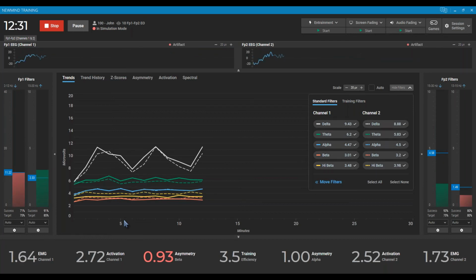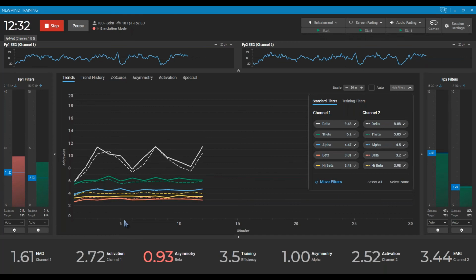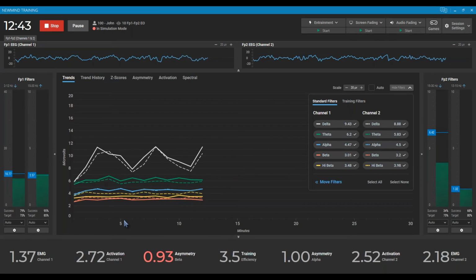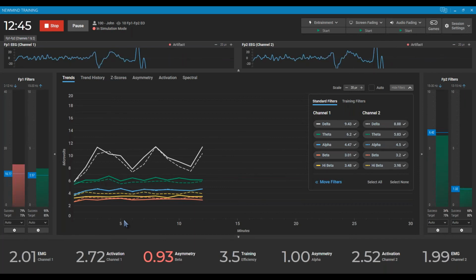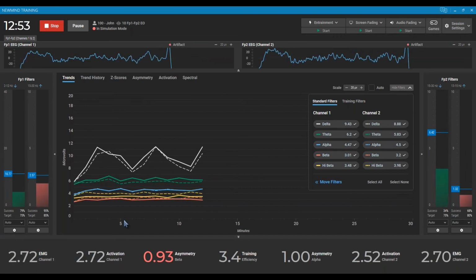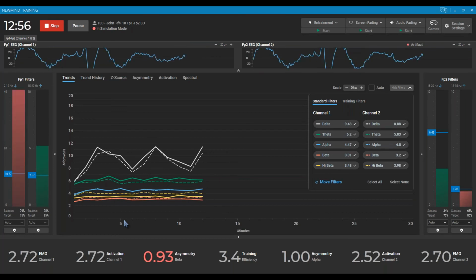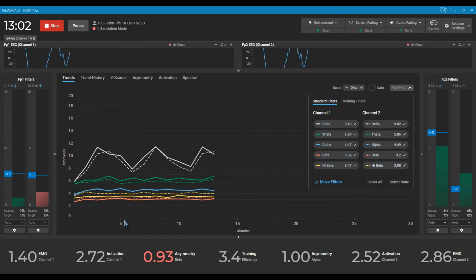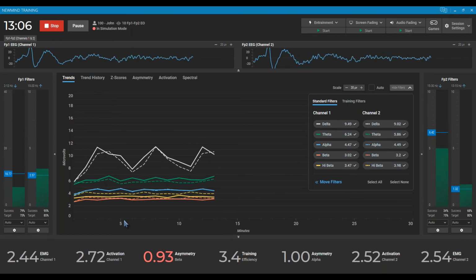Yeah, I was the same. I always did at least the first session as a baseline. I didn't adjust anything. I didn't play with target percentages or reward percentages, however you want to talk about those. But yeah, I was always a fan. I wanted to get them just into the process, and then a session or two in, I would do the same thing. That's when I started moving things around, trying to improve on the settings to get them in the optimal training.